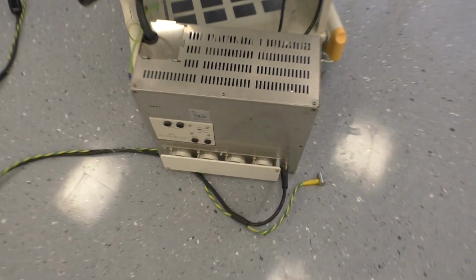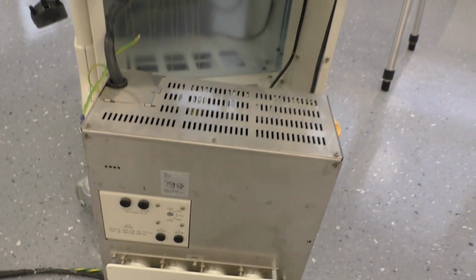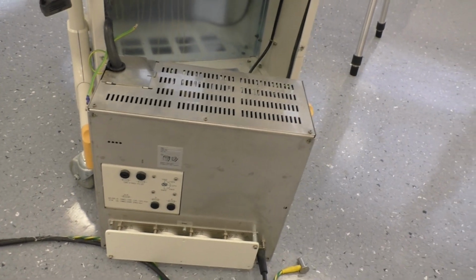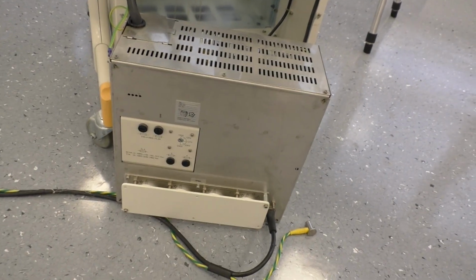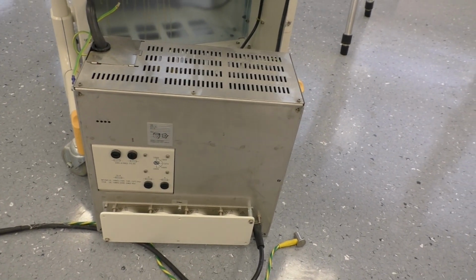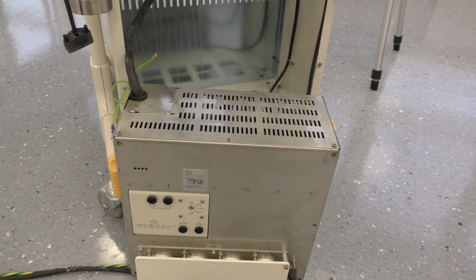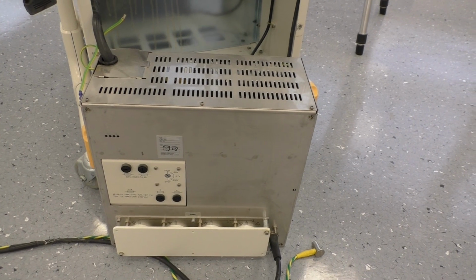Okay, that's about the heaviest part of the entire machine. Power supply. I expect a big mains transformer inside. An insulating transformer, perhaps. Well, let's see if I'm right.